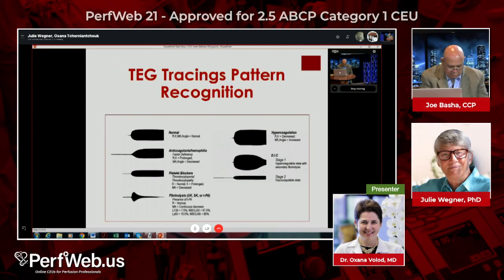All right, so I finished with the R cases, and I would now like to put everyone's attention on fibrinolysis. With conventional assays, even in a specialized laboratory as we have in our institution and many other laboratories, we would not run assays to assess fibrinolysis. The beauty of the TEG is that it shows us potentially pathologic fibrinolysis. Usually when a clot forms, eventually it should be dissolved by our own fibrinolytic system. However, if we see fibrinolysis 30 minutes after MA is formed, that is pathologic fibrinolysis.